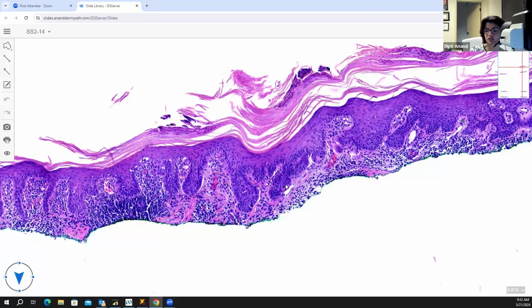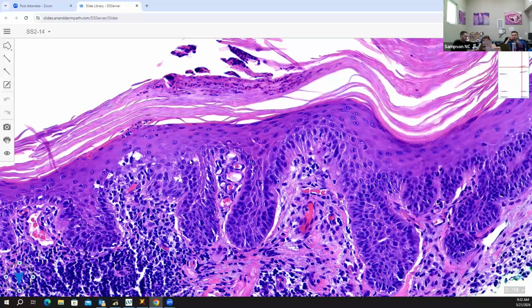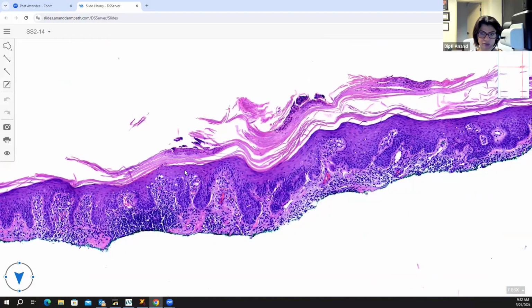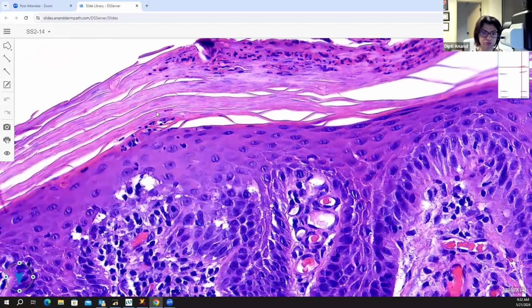Yes, this is actually beautiful for psoriasis. So it's almost forming like a guttate lesion of psoriasis. PRP will not have neutrophils in the cornified layer. You're clearly seeing neutrophils in the cornified layer in here, right? And PRP also will not have diminution of the granular cell layer. So you can actually see that the granular cell layer here is absent. The pattern of cornification is not really checkerboard, plus the presence of neutrophils. You see here, there's actually neutrophils actively pouring out into the stratum corneum.